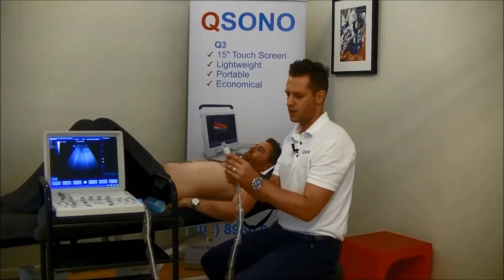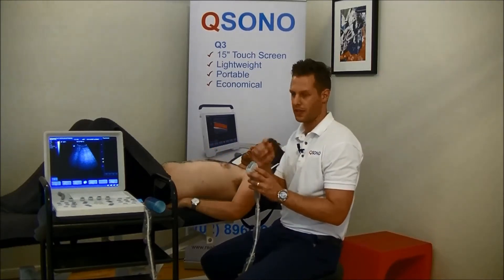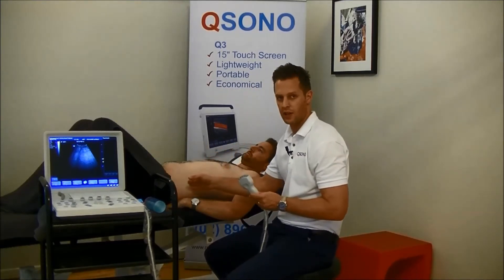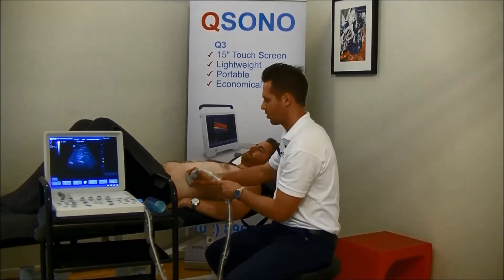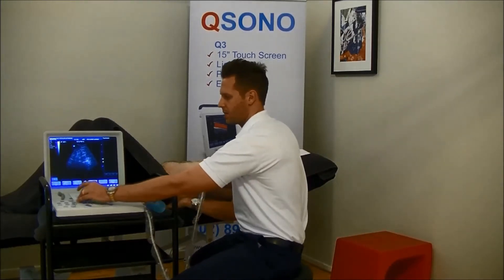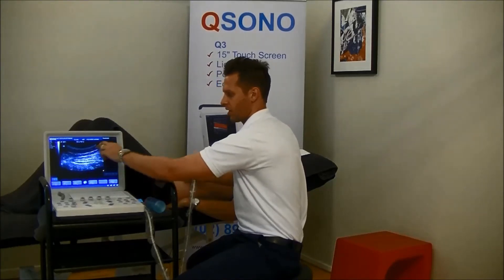The way to align yourself with the probe is that this little dot here is the left-hand side of the screen with the ultrasound image. We're going to put this little dot always either on the patient's right-hand side or facing their head. The best place to put your probe to get an image of transverse abdominus and internal and external oblique is between the iliac crest and the bottom of the ribs, just coming laterally to the mid-axillary line. We're going to find our transverse abdominus about here. The next thing we have to do is adjust the depth, so the transverse abdominus, internal and external oblique are only taking up a very small section of the screen. If we bring our depth in using our depth button, we'll be able to see all three layers on the screen.